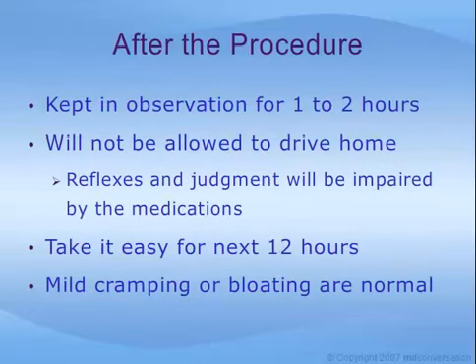Following the procedure, you will be kept in an observation area for 1 to 2 hours or until the medication given wears off. As noted, you should have a ride home arranged, as your reflexes and judgment may be impaired for the rest of the day, making it unsafe to drive or operate any machinery. Your doctor may recommend taking it easy for the next 12 hours. You may have some cramping or bloating that can be relieved quickly with the passage of gas, and you should be able to return to your normal diet upon going home.